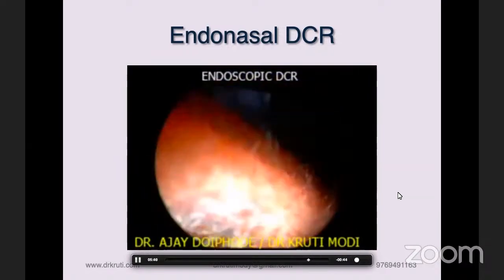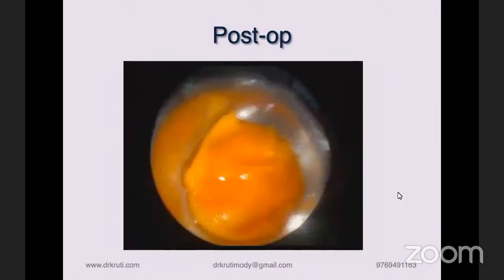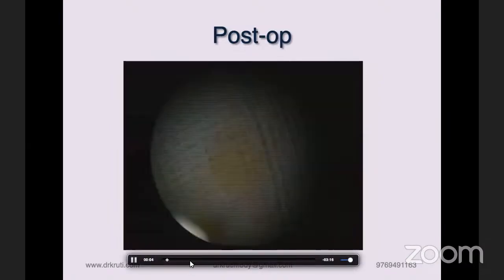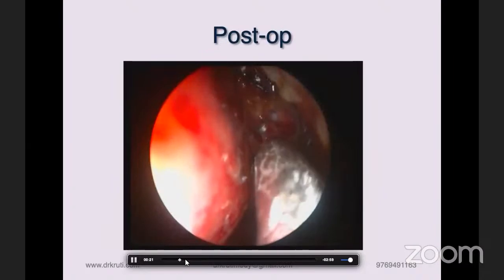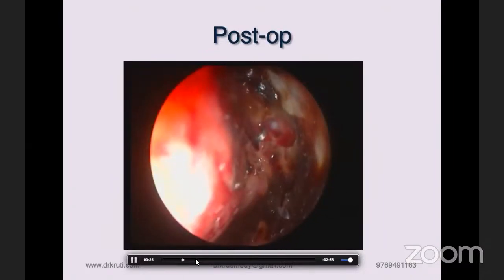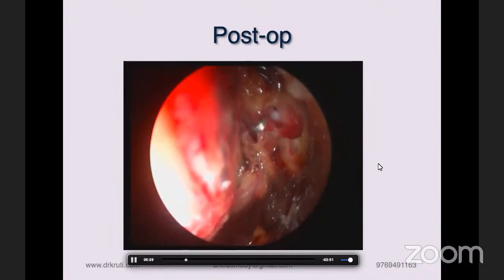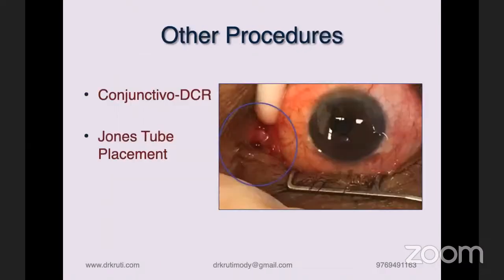So I think that's what we have. This is postoperatively. So you can see the clip. There's a little bit of a pause because it's the first day postop. First week postop. But there are other procedures which we have not covered.